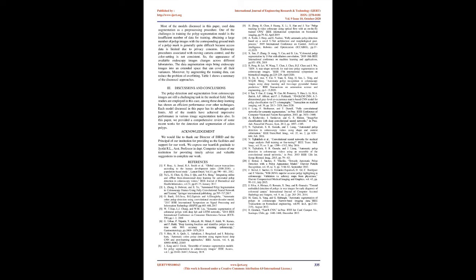3. Discussions and conclusions. Polyp detection and segmentation from colonoscopy images are still a challenging task in the medical field. Many studies are employed in this case. Among these, deep learning has shown an efficient performance over other techniques. Each model discussed in this paper has its advantages and limits. All of the models have achieved impressive performance in various image segmentation tasks also. In this paper, we provided a comprehensive review of some recent works for the detection and segmentation of colon polyps.